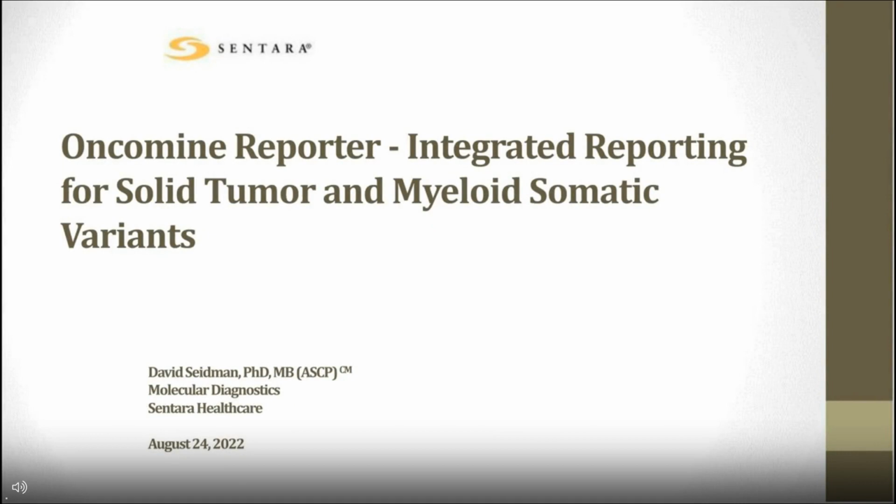Thank you for the introduction, and thank you for the opportunity to present to you today some of the work that we conduct in our laboratory around somatic variant reporting and analysis. Specifically, today I'm going to be talking about our usage of Oncomine Reporter software and how we've utilized that in our laboratory for a standalone integrated reporting mechanism for some NGS profiles that we perform.